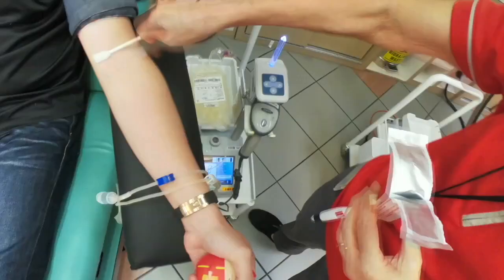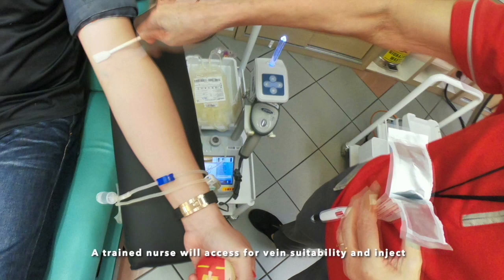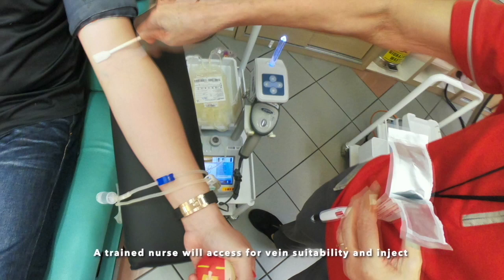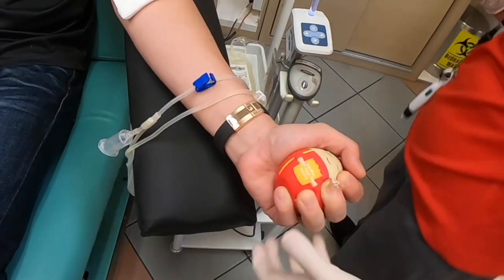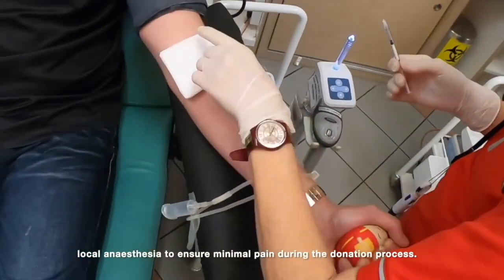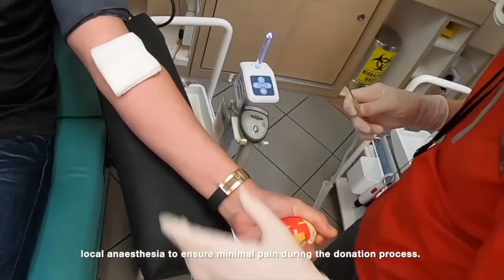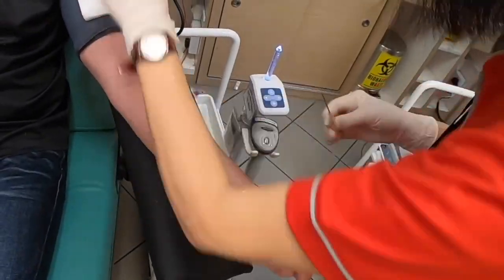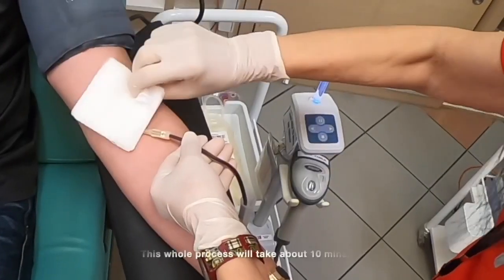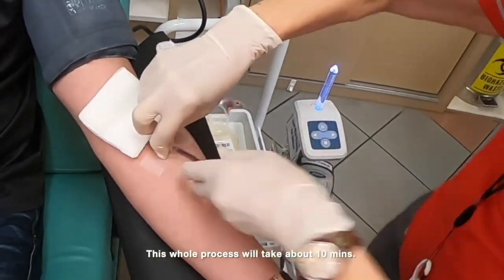In the donation room, a trained nurse will assess for vein suitability and inject local anesthesia to ensure minimal pain during the donation process. This whole process will take about 10 minutes.